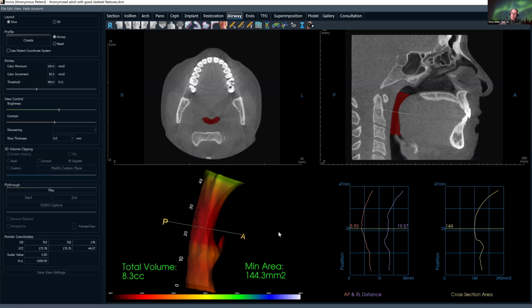The other key feature, not just that you're supine or upright, which is an important distinction, believe me, is also just how you're positioned in the scanner. If you're positioned with this lordotic curvature of your cervical spine, coming forward, you're actually going to open that airway up. If you're back, you're going to close that airway. We don't really know. We can look. This is pretty upright if you look at the cervical spine. So I do think about that, and we'll make a note when that happens.